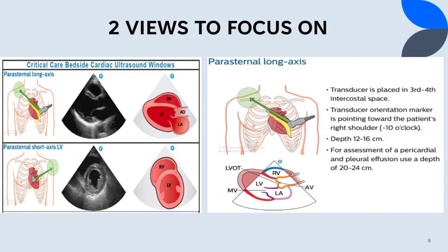This is one of the recommended textbooks that are used, especially if you want to study POCUS, as it covers the majority of the POCUS protocols.